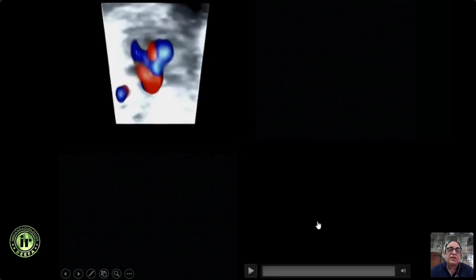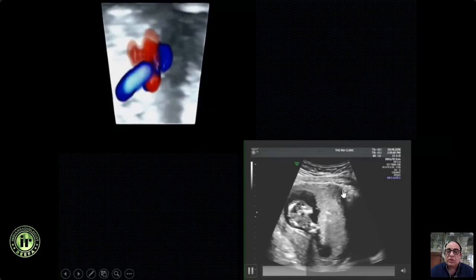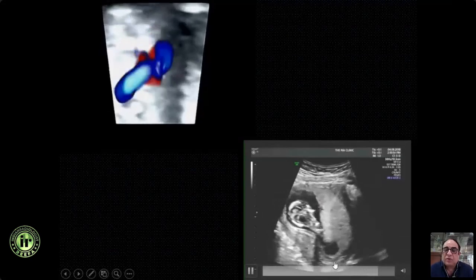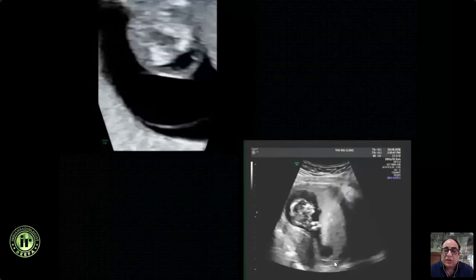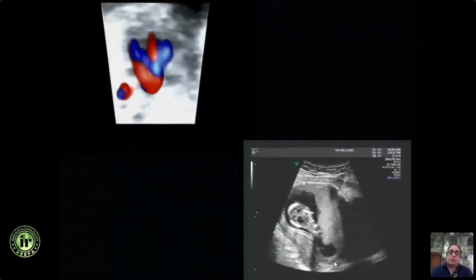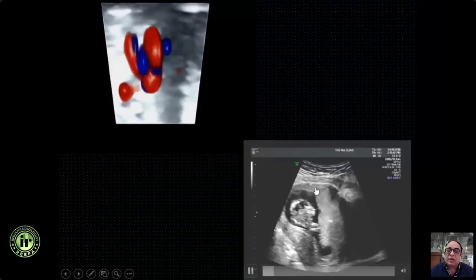Now, this is a recently done procedure. The patient had a Fallot's at the first trimester, and you can see that's the anterior placenta. Now, there's often a concern that if your placenta is accessible, you can do a CVS, but what if it's a posterior placenta? Therefore, the transcervical route was thought better for posterior placentas. And I hope to show you that we can do all placentas transabdominally.